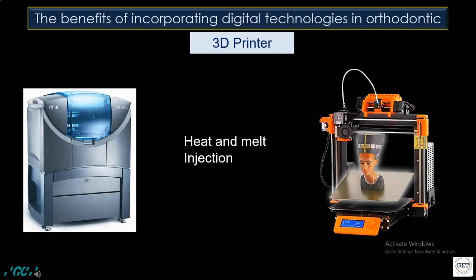The first technology of 3D printers used injected melted resin. The resin is heated and then injected through a moving nozzle over the printing platform. The accuracy and smoothness can be at a high level due to the uniform dispersion of the resin. The disadvantage of this technology was that only one type of resin could be used.